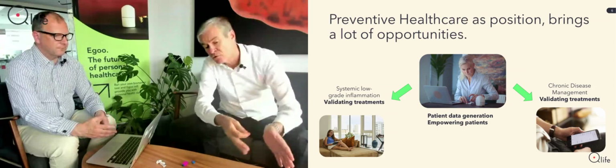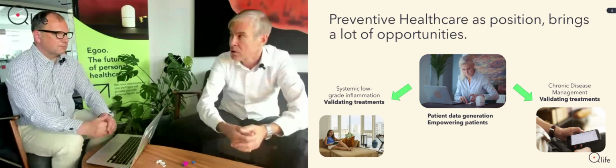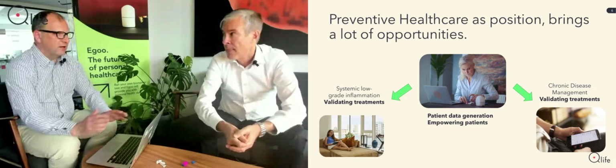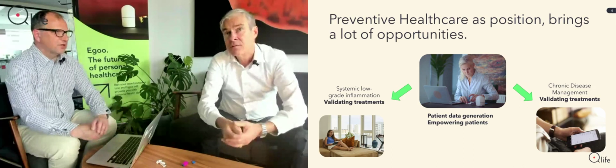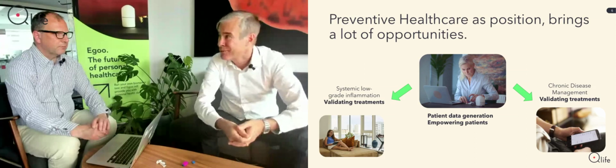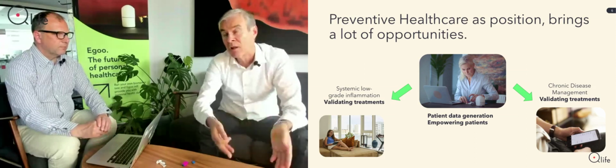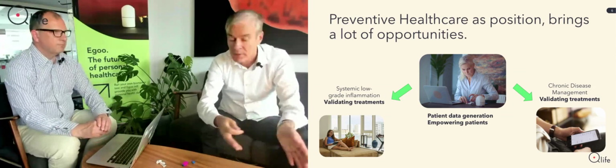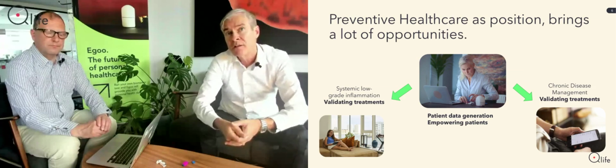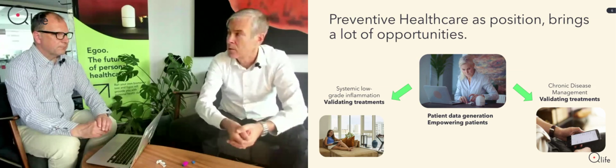And that's something you should monitor over longer periods of time, obviously it's not happening the same day. So what is typical there? 6 weeks? Yeah, 6 to 8 weeks, maybe more. And of course, what we would like is that once the patient gets a feel for it and wants to have that data point on their treatment, they can do it themselves in the home. But right now we are focused on these private clinics because we think that can really improve the quality of the offering, so to speak.